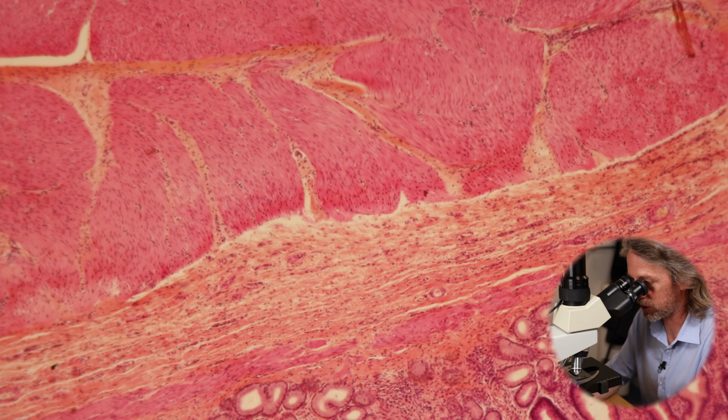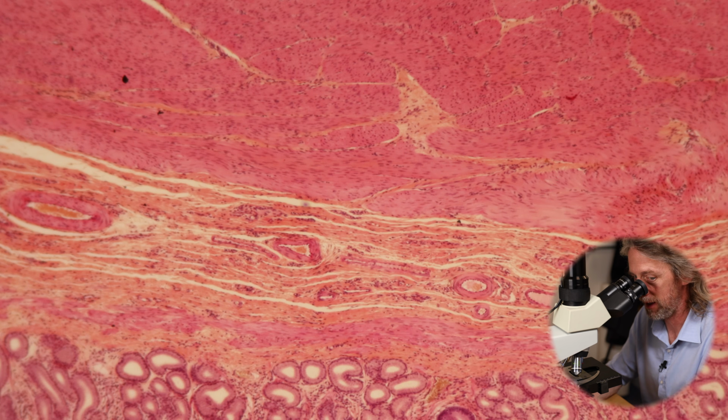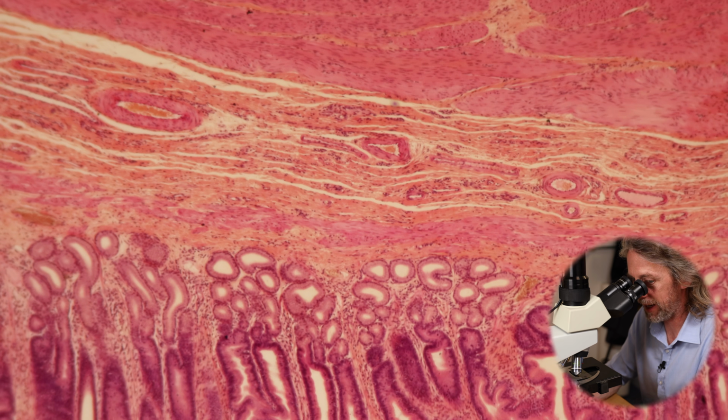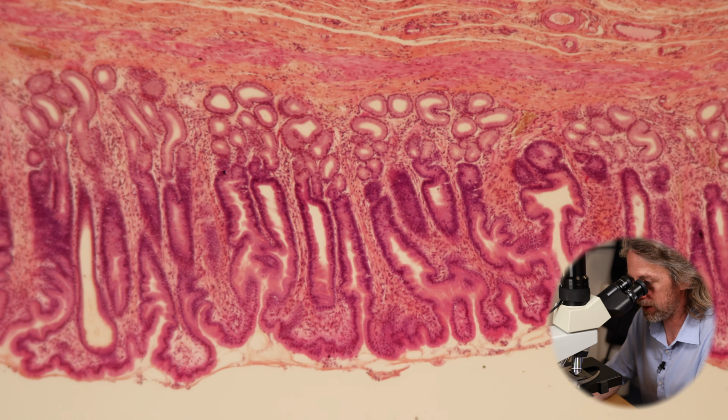The muscle is then up against the submucosa, where, if we go over here, we can see quite nicely actually, blood vessels, little arteries, little veins, lymphatics, nerves. And then we've got that thin layer of muscle in there, the muscularis mucosa. So now we start looking at the mucosa. And then the layer next to that is the lamina propria. And then, this is a really nice, deeply stained section. You can see the gastric glands.